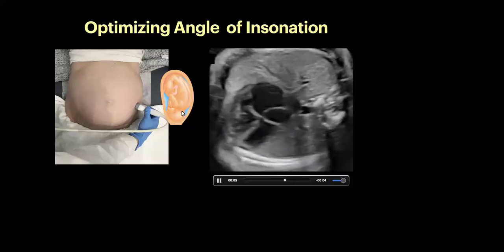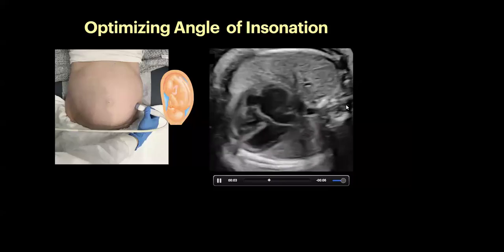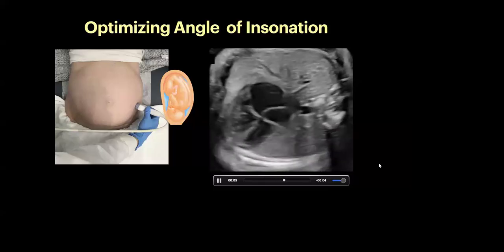Here you could see where the fetus is lying is towards mom's maternal left. Just take a look at where my probe is actually at. And this is what we actually see. Here, there's a lot you could see.